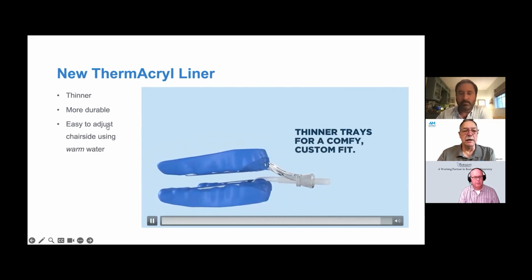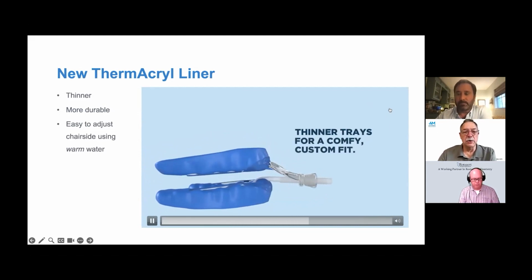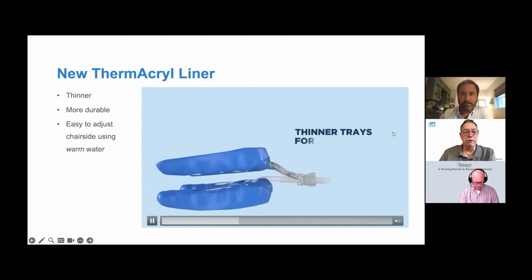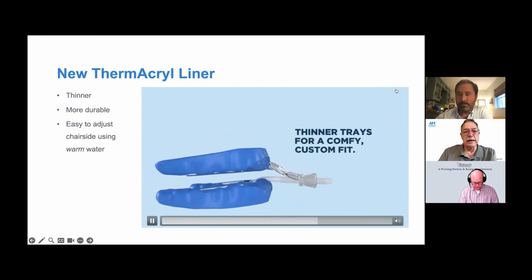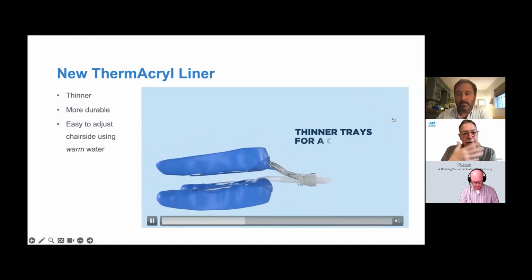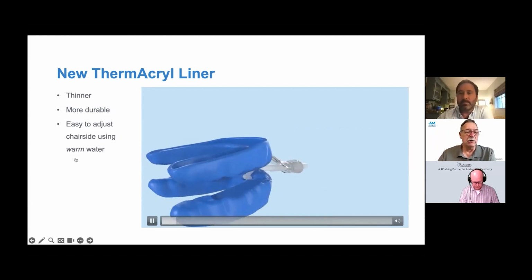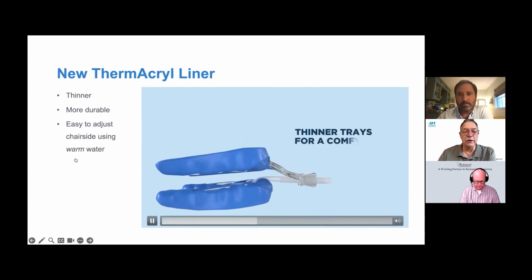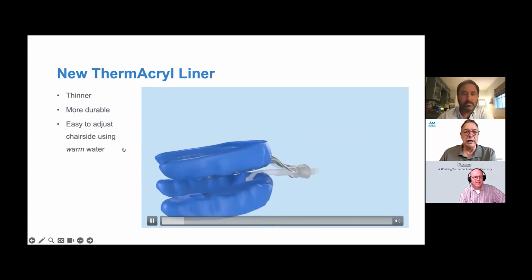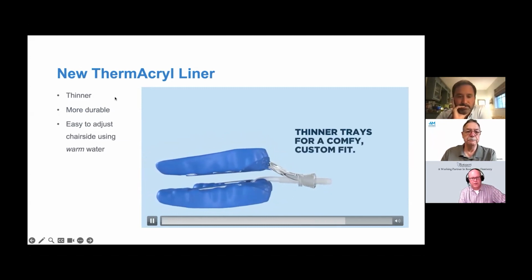All we do is, the patient can do it. The dentist, in my practice, I don't do any restorative care anymore. So the patients are getting crowns from their primary care dentist. And so that dentist can just warm up the tap and put it in and out a few times and it's fitted. That's it. The patient can try that too, because they can't ruin it. The only way they can ruin a MyTap or FlexTAP is to boil it. And they're not going to boil it. So they just heat it up a little bit and put it in their mouth, and it fits really nicely. It's really great that way.